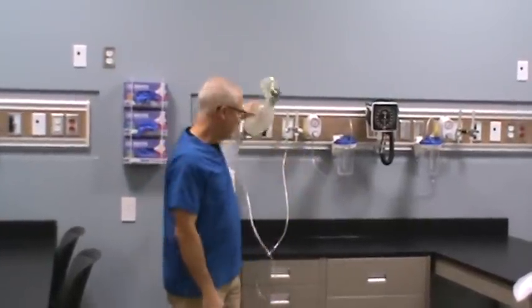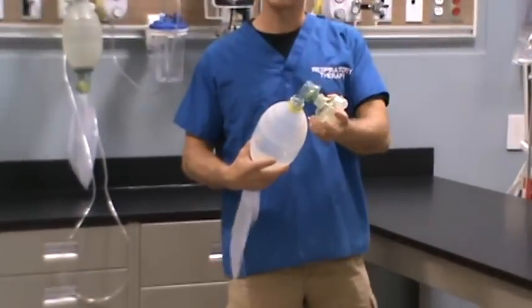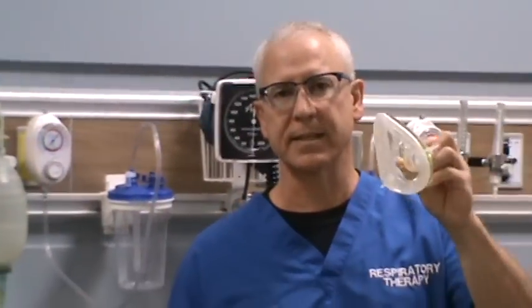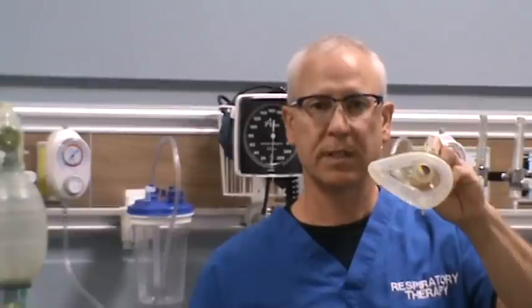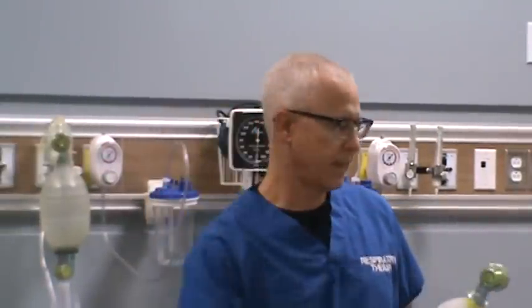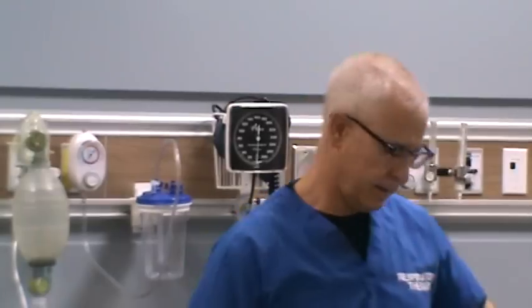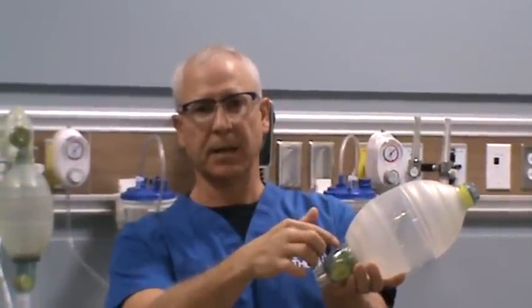Let's take a look at the different parts of the manual resuscitator. If we break it down and take it apart — the first thing we have is the mask. The mask needs to maintain a seal between the patient's face and the mask itself. Next we have the optional reservoir. We also have the patient valve assembly, and last but not least, the bagger itself, as well as the gas inlet valve assembly.